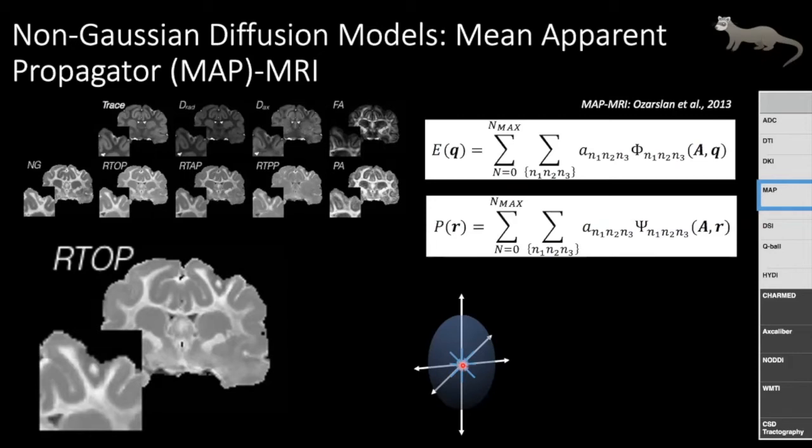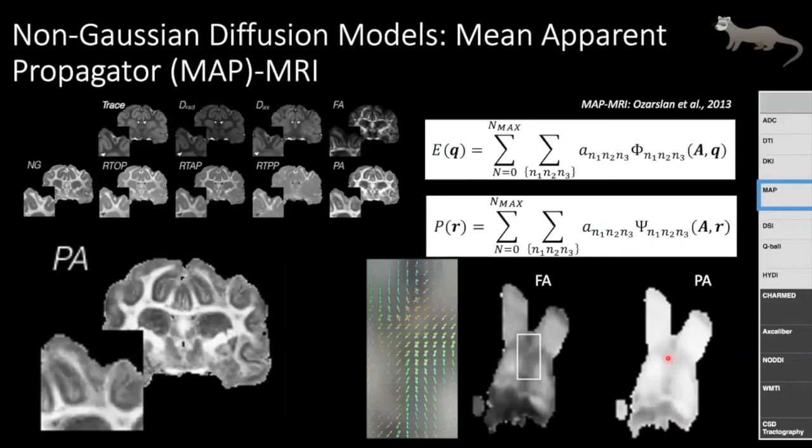And this can be useful if we're thinking about restricted compartments. If we had a whole bunch of fully restricted compartments, this would have exactly the inverse of the pore volume of those compartments. So it's a nice metric to look at and think about.